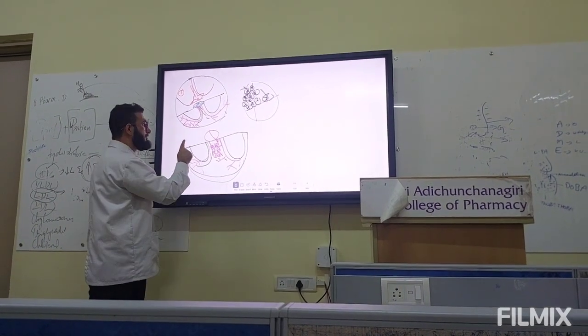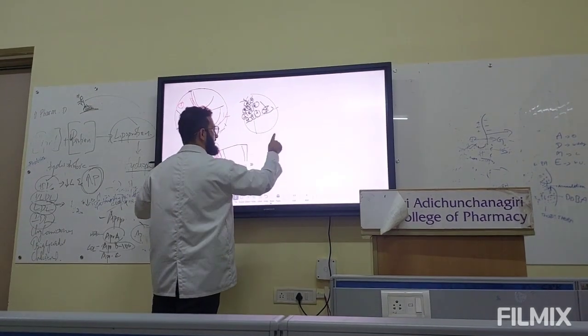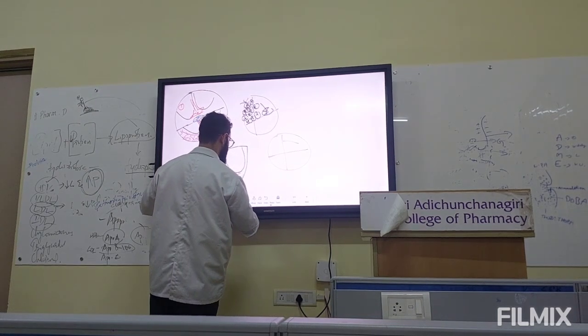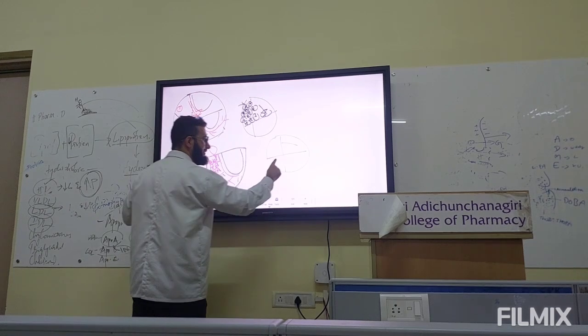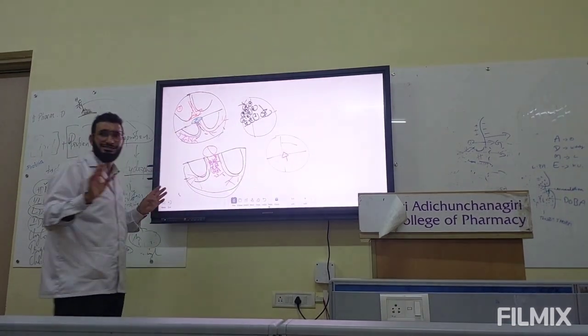So it's going from the vector here. The septal depolarization is going to make a vector in this direction. You are understanding.